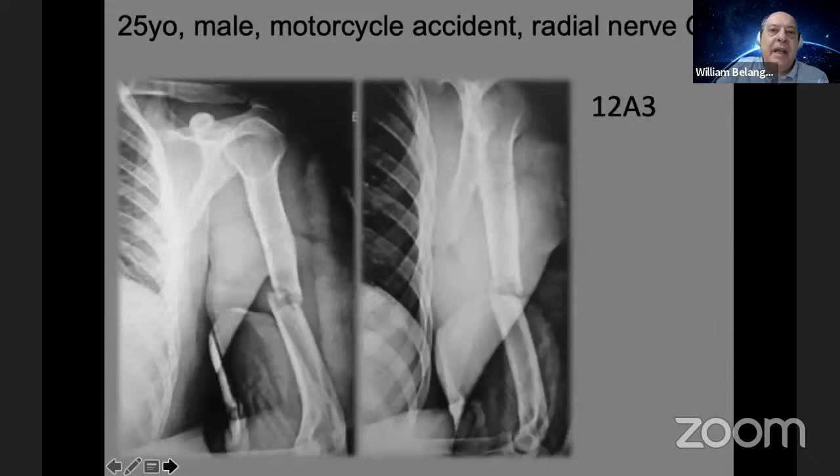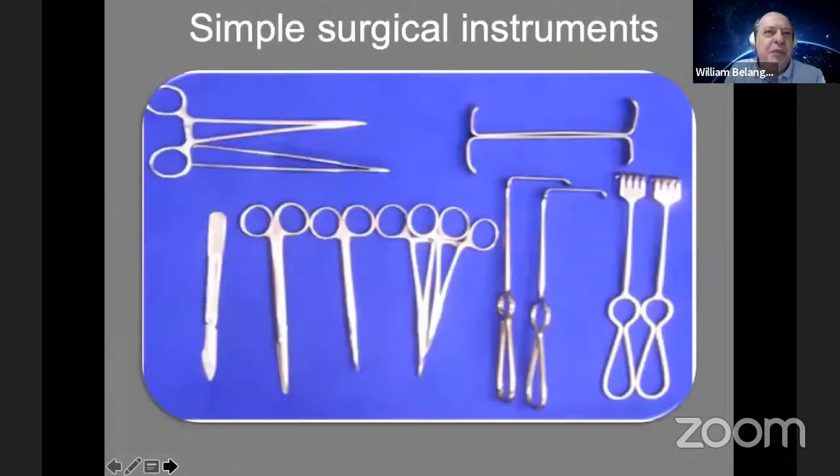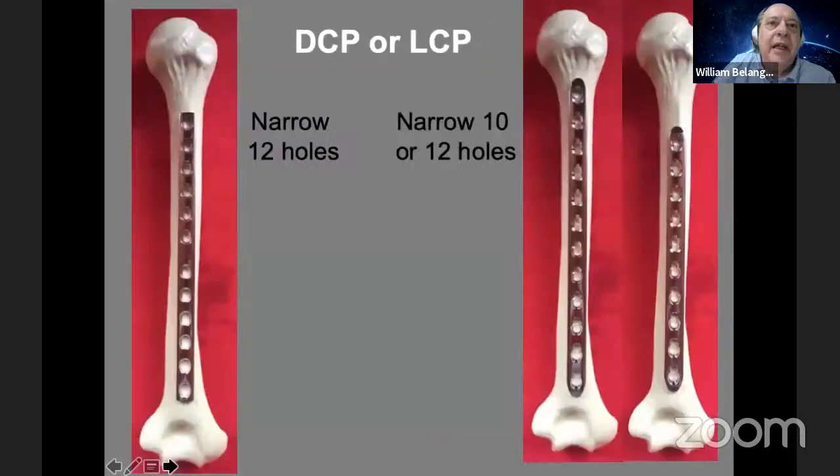This is a simple fracture to present the current technique. I think this procedure has several advantages, mainly for our countries, because it is simple, safe, reproducible, and does not need sophisticated or expensive instruments and implants, as you can see here. Besides this, I'm sure that the learning curve is very short. I prefer to use DCP plates, but it's very difficult because nowadays we have LCP plates, and I use LCP plates, in the majority of cases with cortical screws, not locking screws.